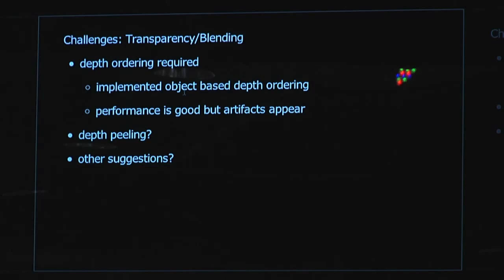We are open: if somebody implemented depth peeling, I don't know if it's possible at all, but I would like to see that. Or if somebody has other suggestions for this issue with transparency, that would be great.